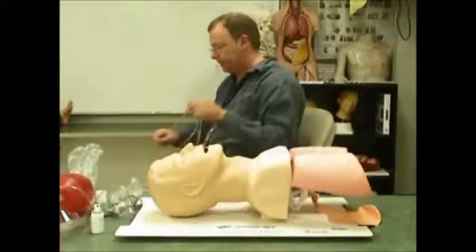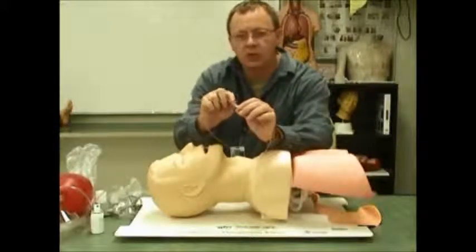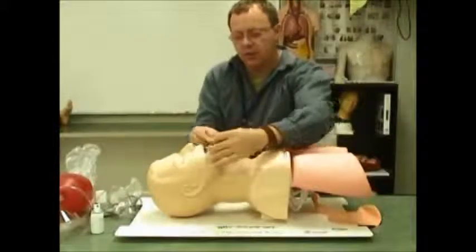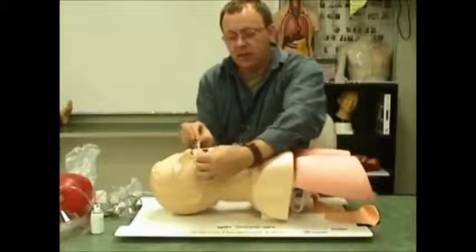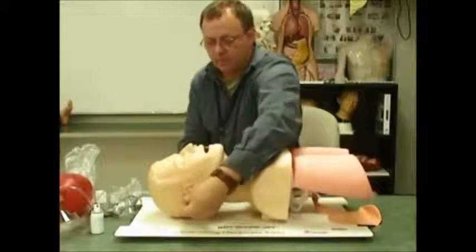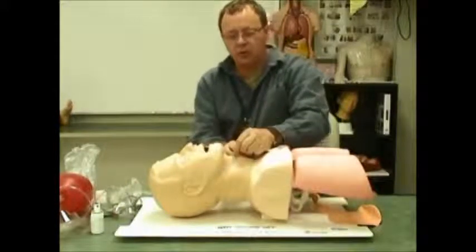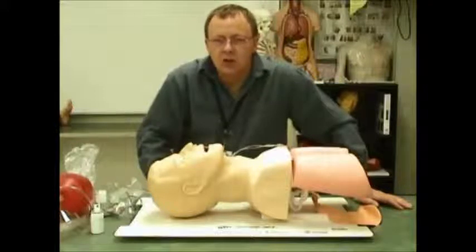I will now connect it. In order to apply the nasal cannula, we first must take note of the direction of the small cannula — the two prongs at the ends. These should be in a downward position as they go into the nares. Always starting from below the patient's head, we insert the cannula in a downward position into the nares, come around the patient's ears, meeting below the chin and pushing the slip-tie up to the bottom jaw. As with any oxygen delivery device, you never apply it unless the oxygen is currently running.